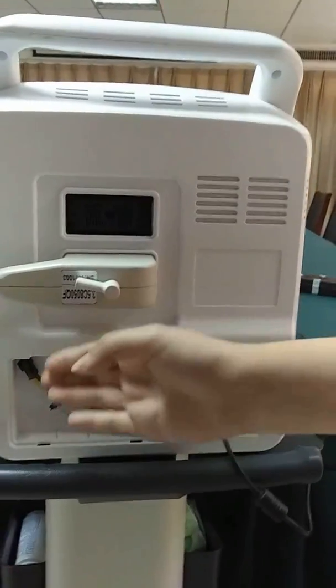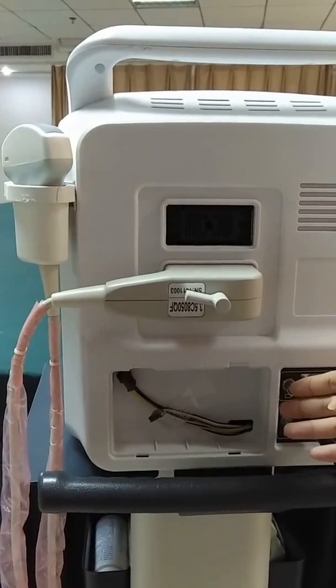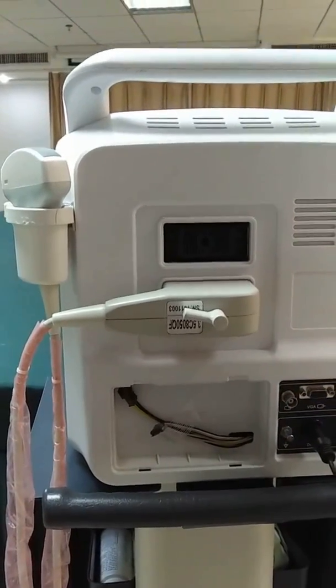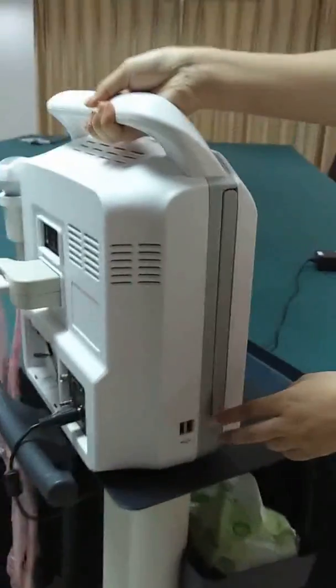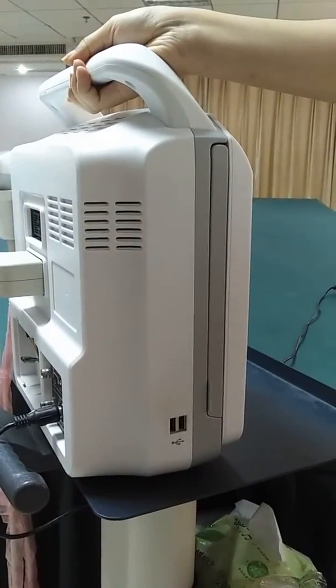This area is above the lithium battery. You can see it is a built-in lithium battery — it is optional, so it is not installed here. And these are the two high-speed USB ports.